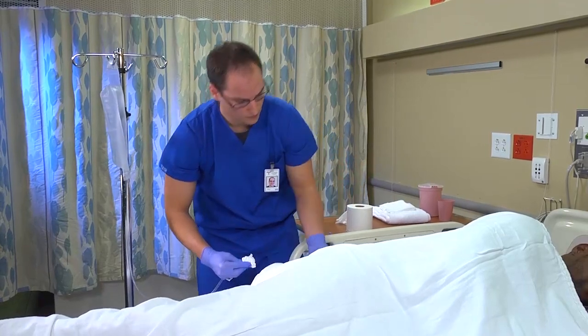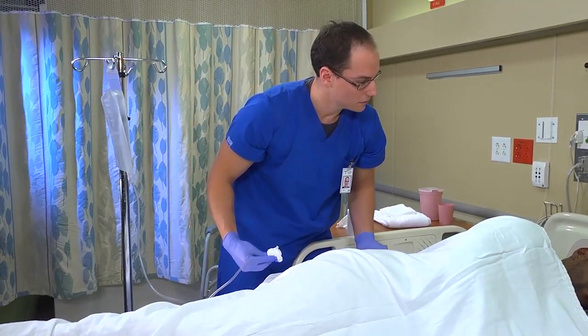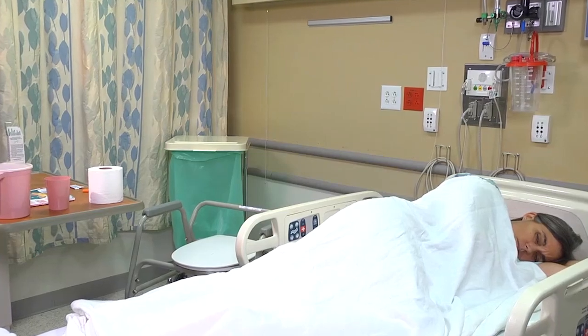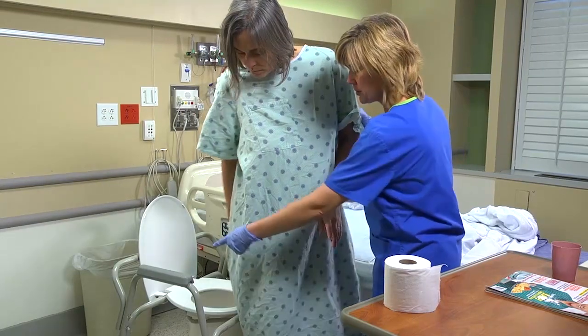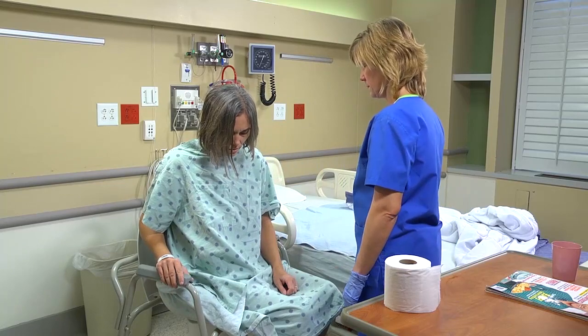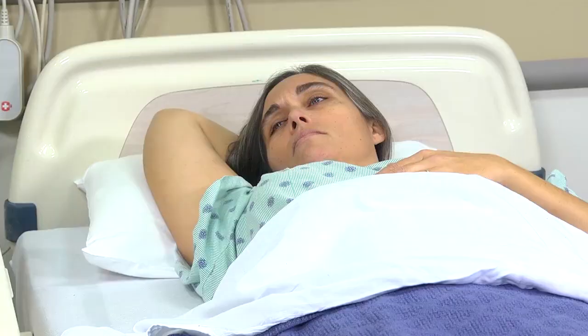For either type of enema, explain that mild bloating and abdominal cramping afterward is normal. Ask her to retain the solution for as long as possible while lying on her side in bed. Stay at the bedside, and when the patient is ready, help her onto the commode or bedpan or accompany her to the bathroom. Observe the characteristics of the stool and solution.